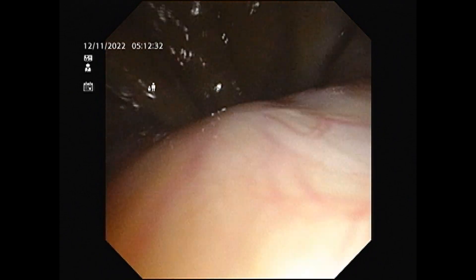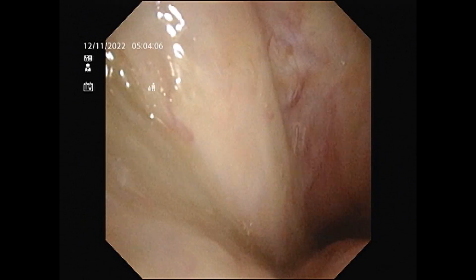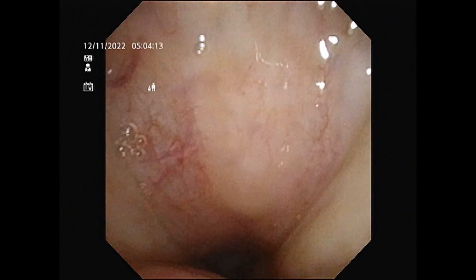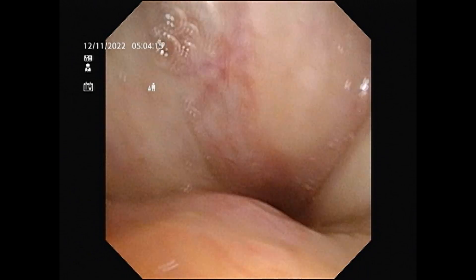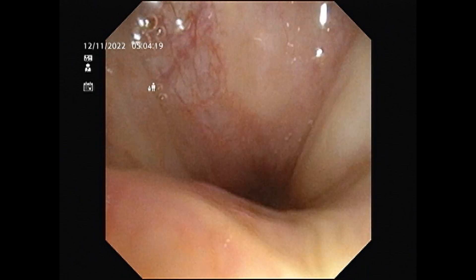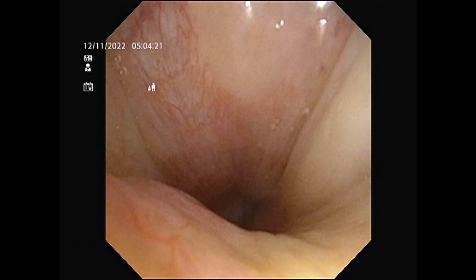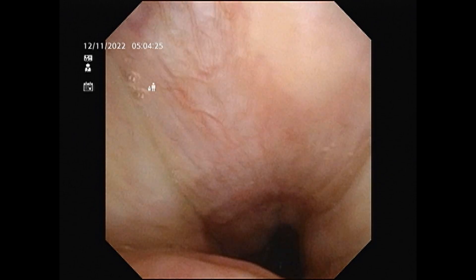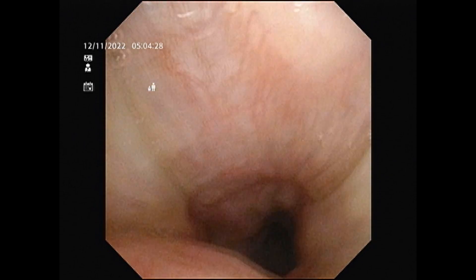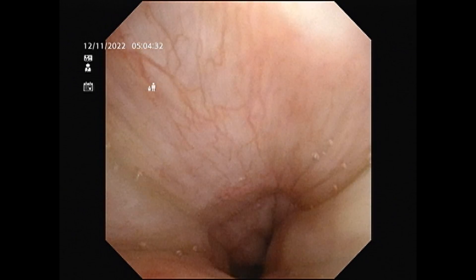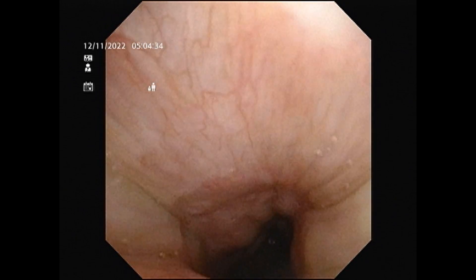I am going to intentionally point the camera facing downwards. What you can see is the patient's right side of the soft palate and the central part. We can see that there is not much space inside because the patient is under the effect of anesthesia. Even though it's mild to moderate anesthesia right now, you can see how the muscles are contracting and narrowing up the space inside. You can also see a lot of secretions present there.